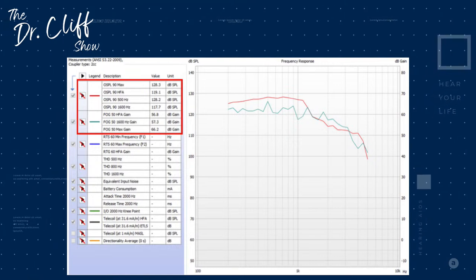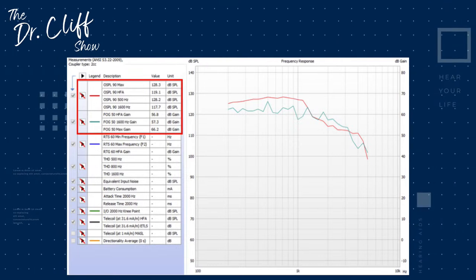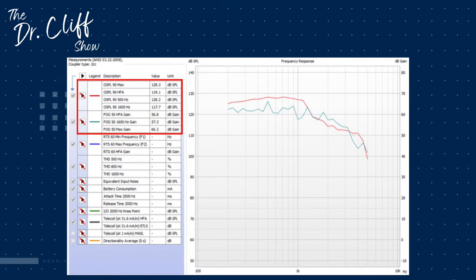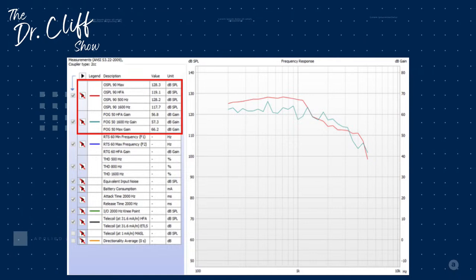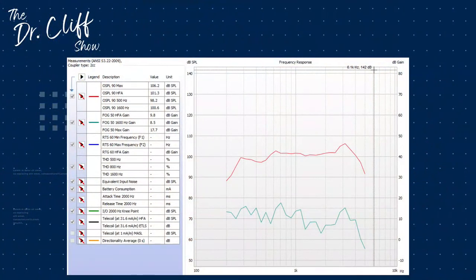However, we can assume that they were within specifications for this patient, and this will make a lot more sense as we're walking through these measures when the hearing aid did not pass electroacoustic analysis. Yeah, and you guys will catch this on this next graphic that we have here, because we have a hearing aid that performed horribly inside of this.